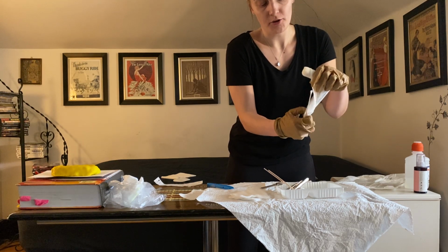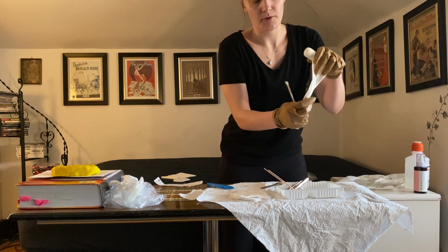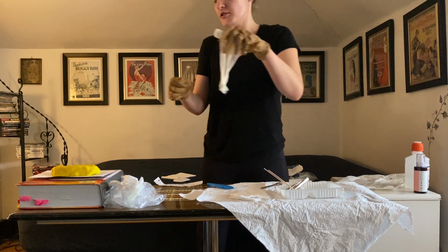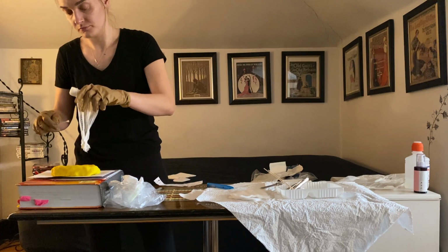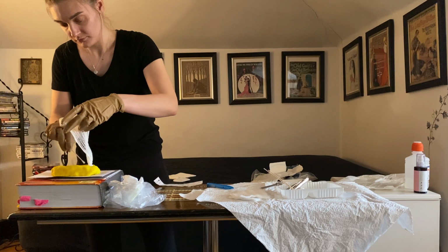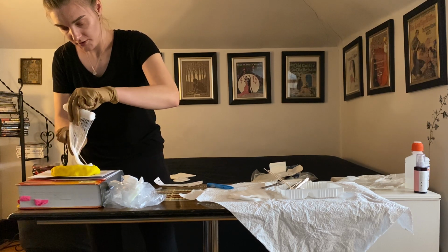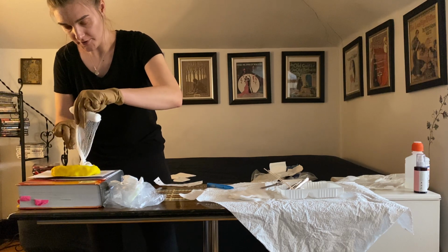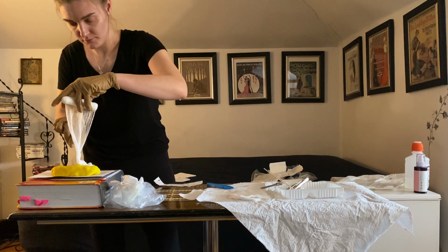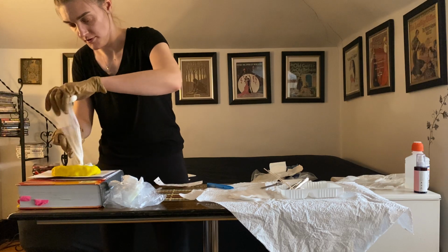So I don't want to pack too tightly, and I don't want to go above the surface of the wound, and I also don't want to touch the peri wound more than maybe 1 or 2 inches outside or at all, just because I don't want to bring any contaminants inside. And again, we're not going above the surface of the wound. I don't want to touch the peri wound.